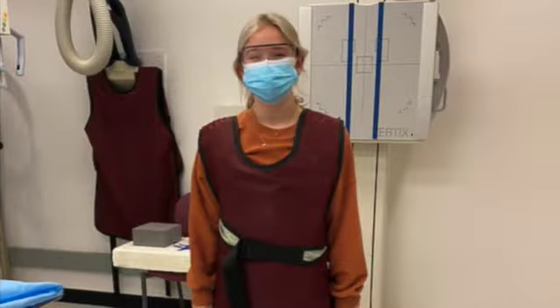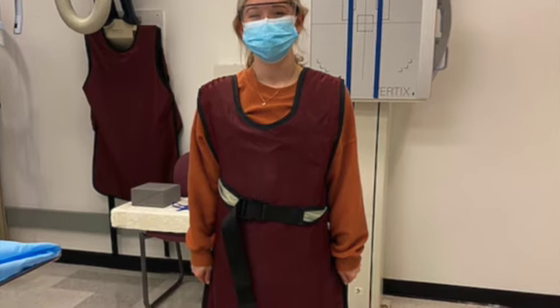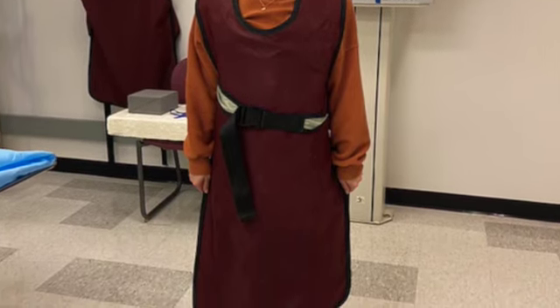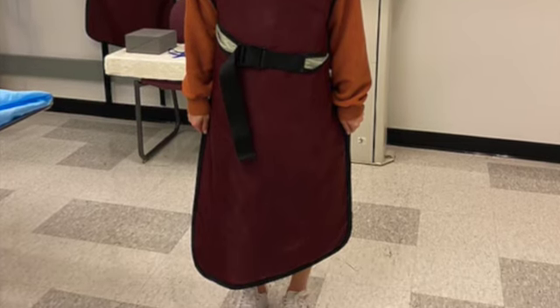This is me demonstrating the use of a lead apron. Lead aprons should always be available when you're using fluoroscopy in the OR. You should always wear this lead apron to protect yourself from extra radiation dose because, after all, you're going to be in this career for a while and you should take the necessary precautions to protect yourself.